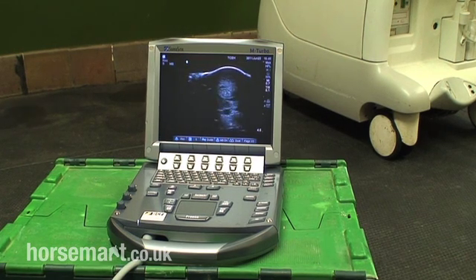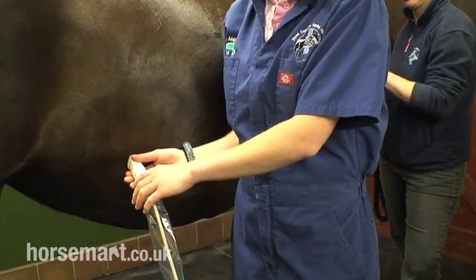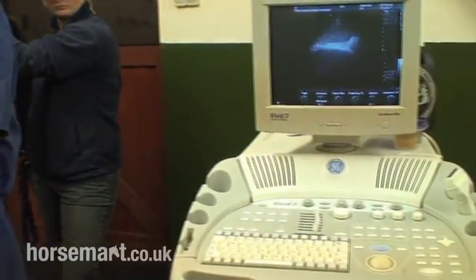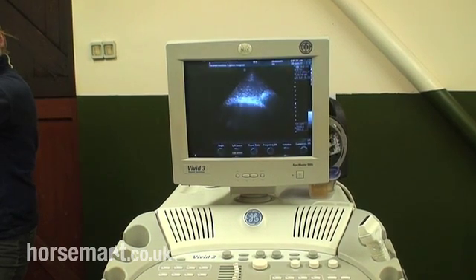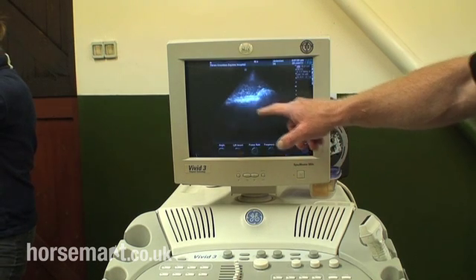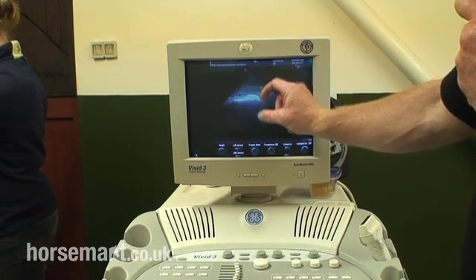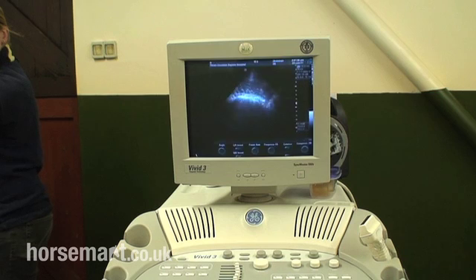What we're looking for when we're doing this is blank areas that might suggest tendon damage or ligament damage. Ultrasonography can be used for a variety of different problems, and one of the uses — demonstrated here by Becky — is to scan the bowels of the horse, the abdomen. This may be a useful technique in the diagnosis of colic, for example. The probe is able to pick up abdominal organs such as liver and kidney, and here it's picking up loops of bowel. When a horse has colic, the wall of the bowel may be very thickened, there may be gas in the lumen of the bowel, or there may be free fluid in the abdomen.